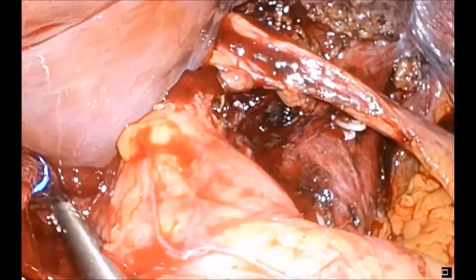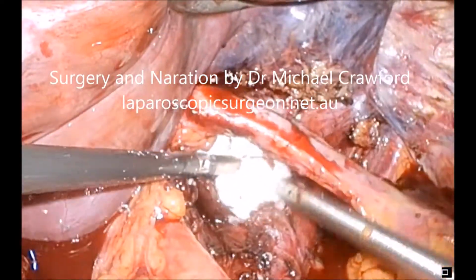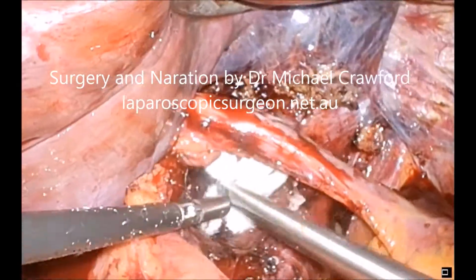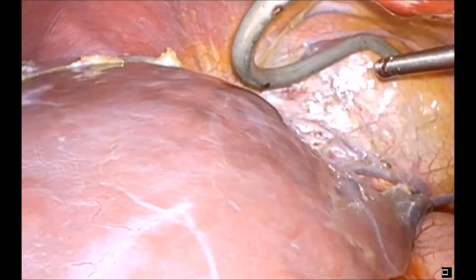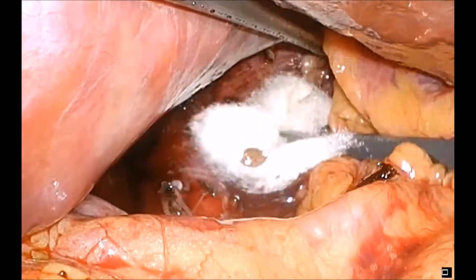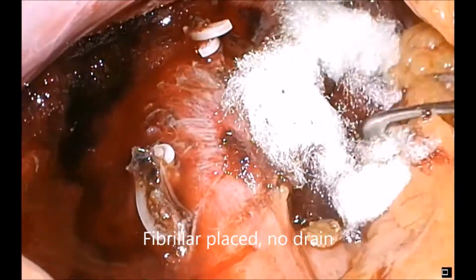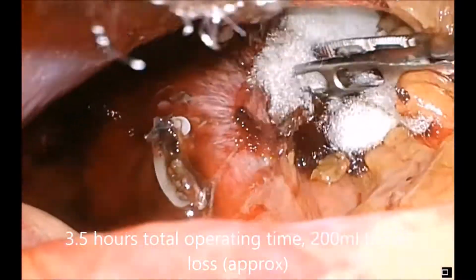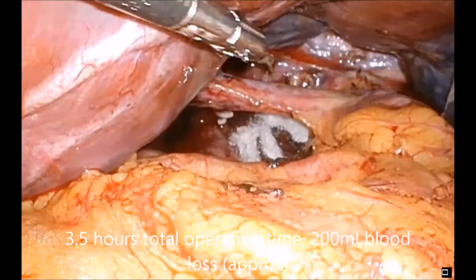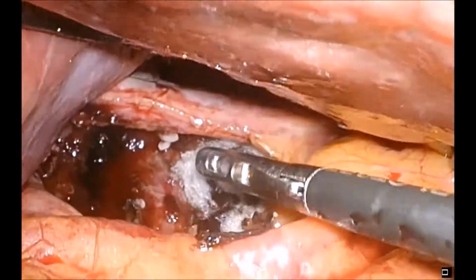A lot of irrigation is performed. A little bit of fibrillar is placed. This will be absorbed by the body ultimately, but helps with clot formation in the short term. You can see that the rest of the liver is not completely normal. Further fibrillar there up against the inferior vena cava, and then we have about a 3.5 hour operation condensed into something like half an hour.